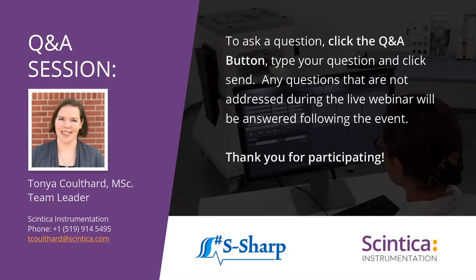Again, it depends on what's in the way. If the skin is very tough and dense, it's going to block most of the sound and affect the penetration. So it depends on the anatomical structure you're looking at, the depth of it, and what you need to see.